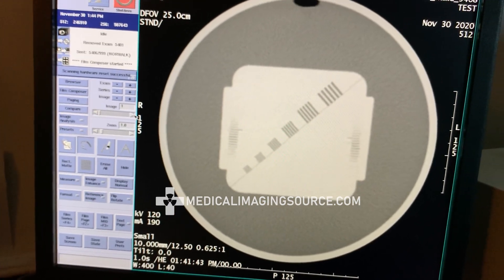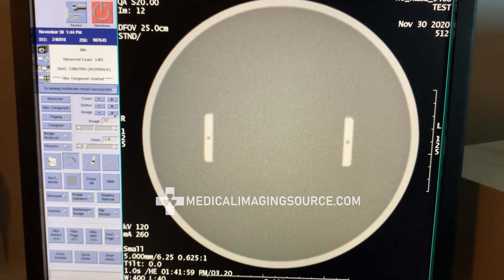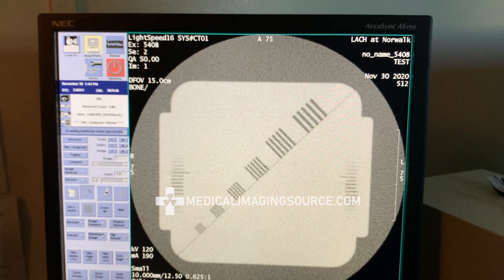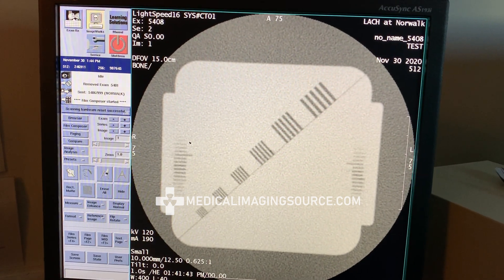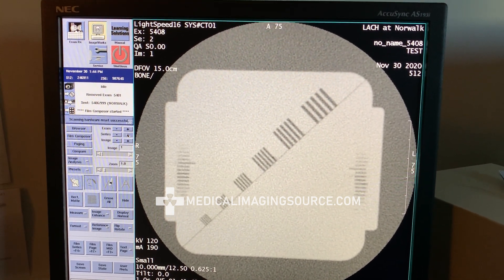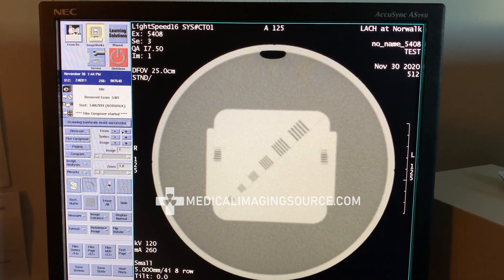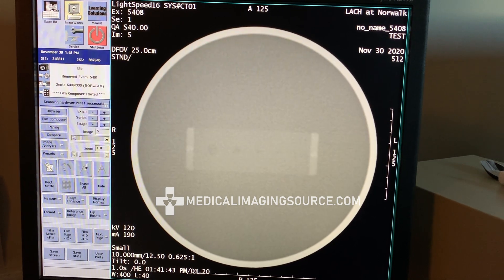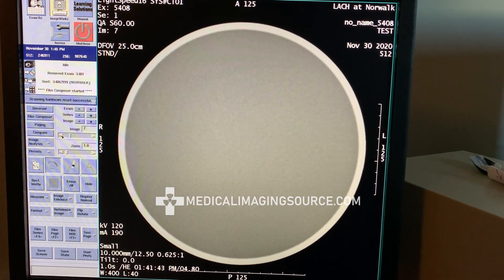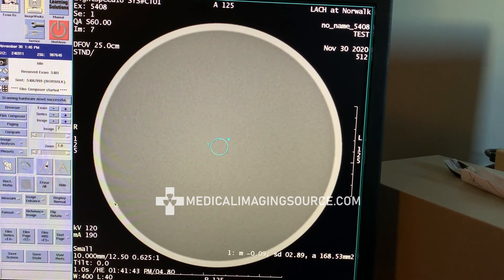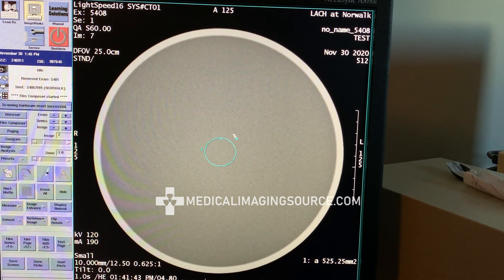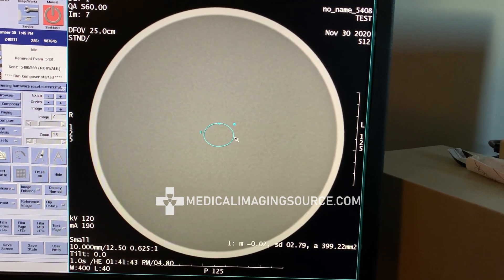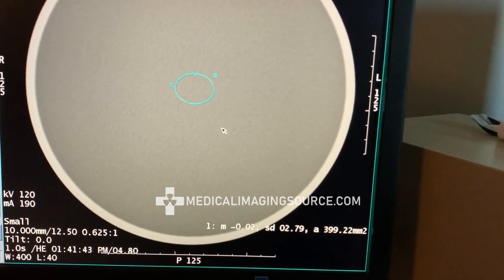From here you can start scrolling through the images with this tab. Alternatively you can use this tab to scroll through your images, go to your next series, and even go from exam to exam. Your first series is going to be best used for your water mean value. We like to use image seven and measure here — I'm going to take about a 400 square millimeter ROI.